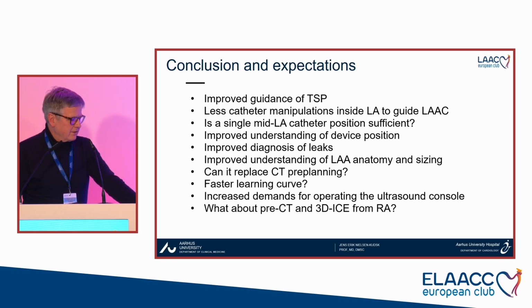Maybe if that is our workflow, we'll have to combine it with the CT, a pre-procedural CT scan. So I think there's a lot of new options with this technology that we have to explore in the future. Thank you.